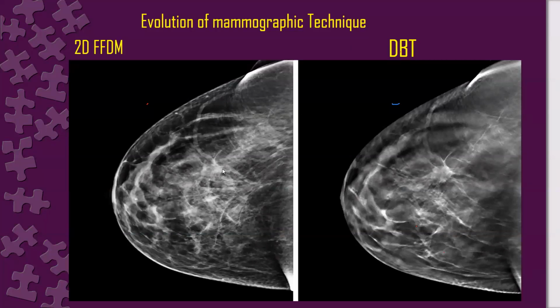So by looking at the 2D and 3D, here again, this is the same patient. Again, the lesion is really very appreciable, showing itself. But here it disappears. Why does it show itself on tomosynthesis, but not on the 2D image? Can you tell me why?